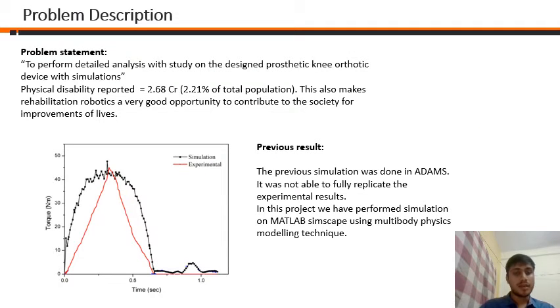The problem I'm working on is to perform a detailed study of the previously developed powered knee orthotic device and rectify the cause of the discrepancy between the simulation and the experimental results. As you can see here, the knee torque values are not matching between the simulation and the experiment. The simulation here shows a parabolic nature.